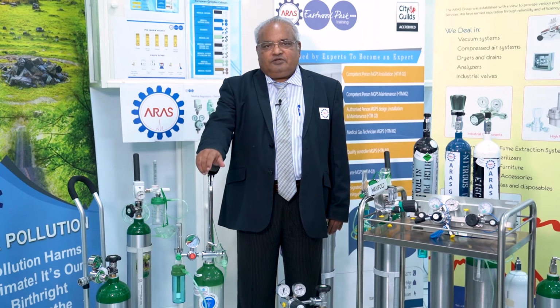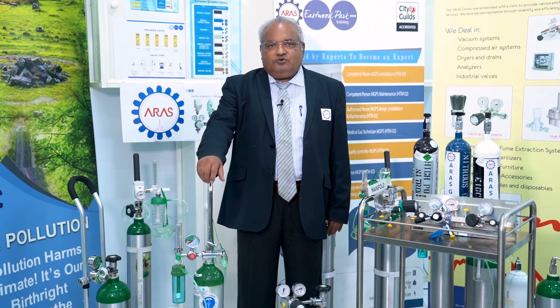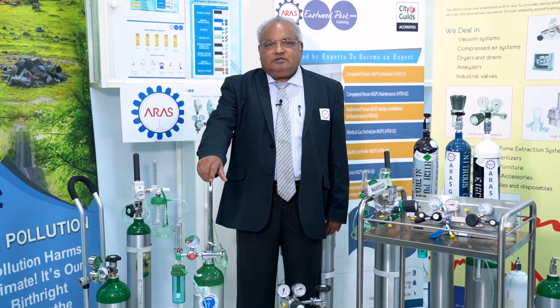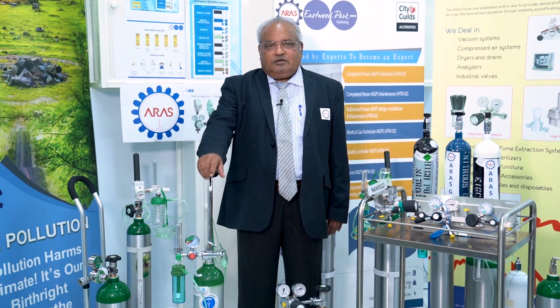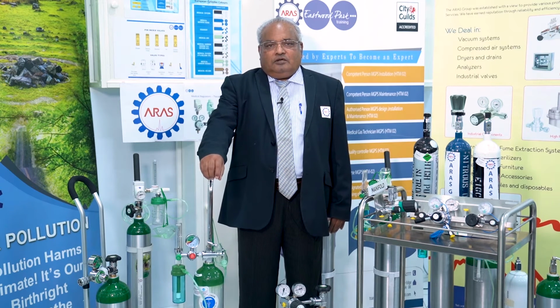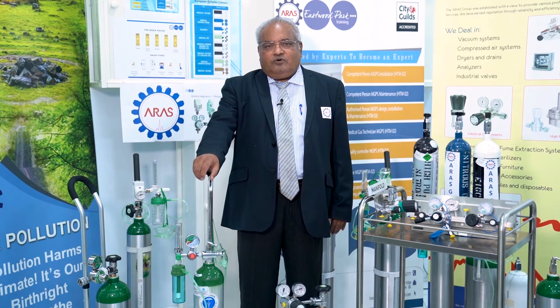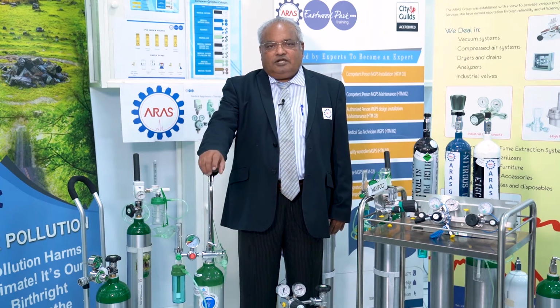The flow meter itself gives 15 liters or whatever liters we require, so you need to use different types of flow meters, because you cannot use a 15 liter flow meter for the same patient who needs 80 liters. If you need 80 liters, you have to use a 100 liter capacity flow meter. So the regulator should be capable of giving a flow of 100 liters or 80 liters, whatever it is.